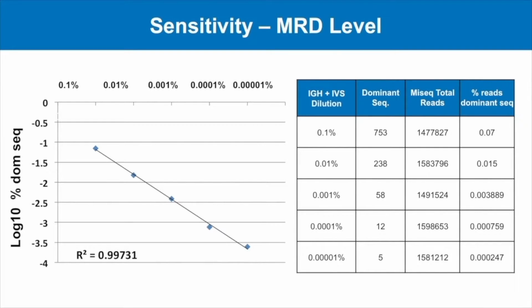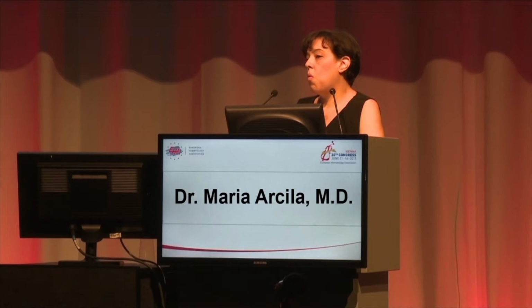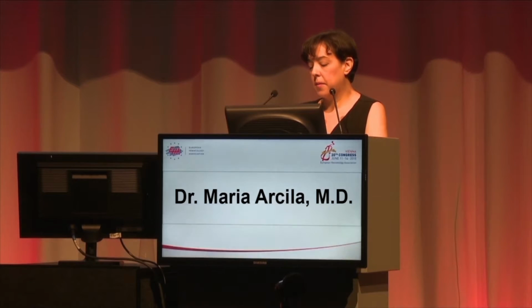But this all depends on how much input DNA you have. So if your input is low and it doesn't give you that many reads, then obviously you're not going to get to that sensitivity. So this is all dependent on how much DNA you have in the sample. For us, we go very conservatively. Even though we have shown that we can go this low, we don't usually say that we can go beyond 1 in 100,000, and we would require finding at least 5 reads to be able to say that we have found minimal residual disease.